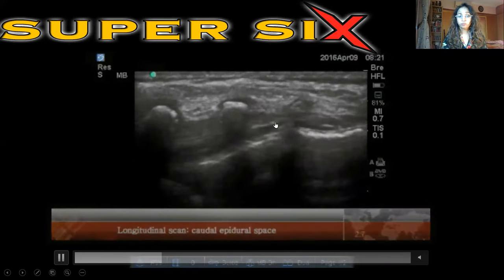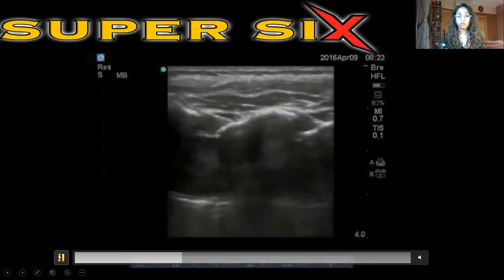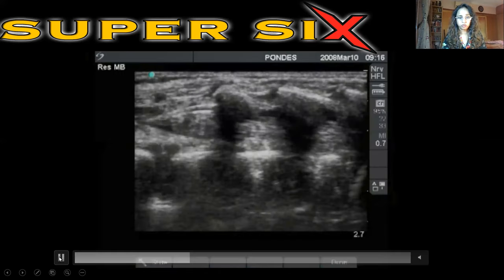You will see that the drug displaces the posterior and the anterior dura and ascends in the central neuraxial conduit. What we can also do is wait at the surgically congruent vertebral level and see if the posterior dura really sags down once the drug reaches there. So it's a telltale sign that indeed the local anesthetic has reached that particular level. So here you go, you will see the posterior dura getting down.